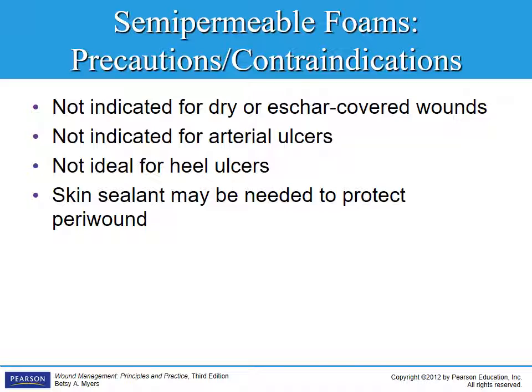It's not ideal for heel ulcers. Simply because of the foam nature, the semi-permeable foam nature of it. With a heel ulcer, their heel ulcers are a little bit different. You want to give them an opportunity to kind of autolytically debride, and a foam won't allow that to happen.